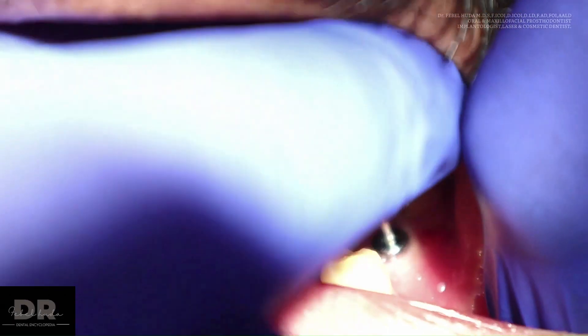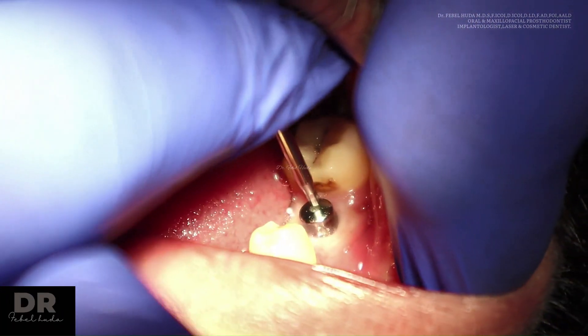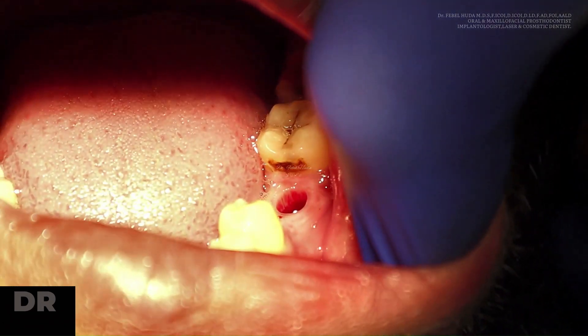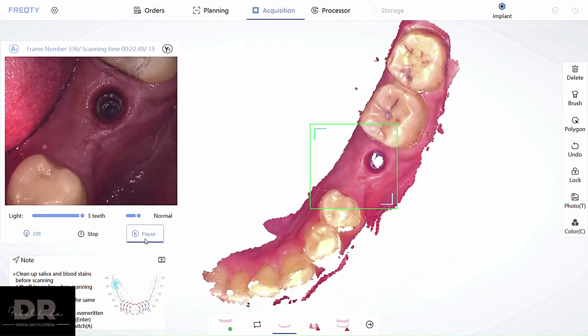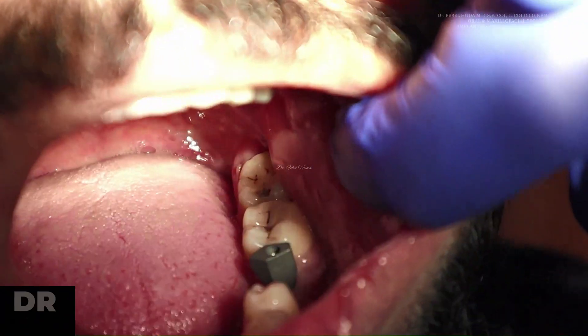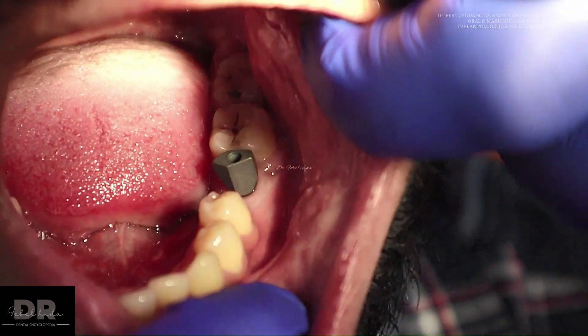We're going to remove the healing cap and perform the second stage: scanning the soft tissue contour. This is a very important step that commonly gets missed by many doctors because they're not used to this workflow. It is critical to capture the soft tissue so that the contours are recorded by the software, as this is essential when fabricating the final crown.